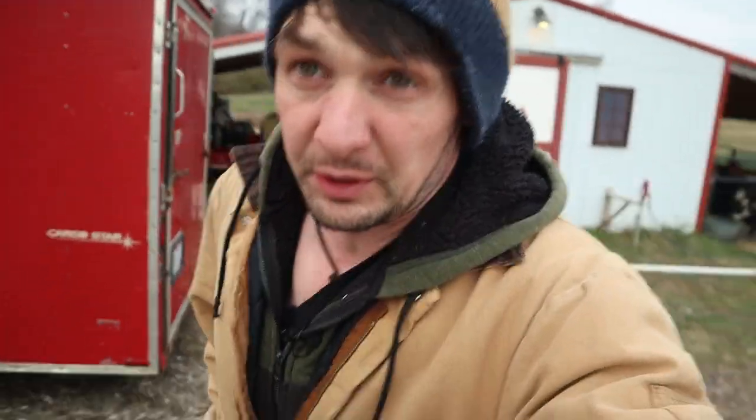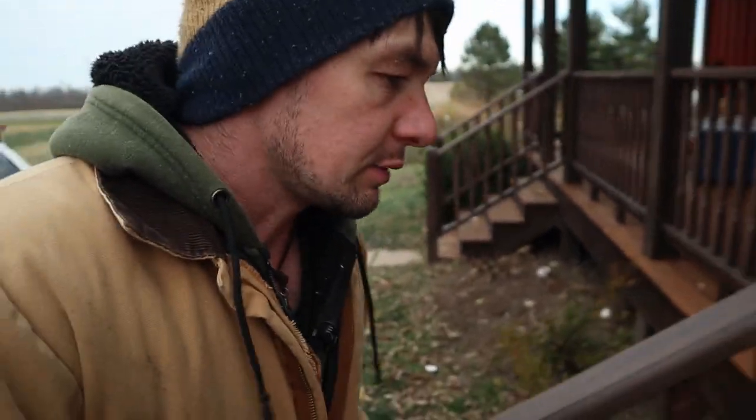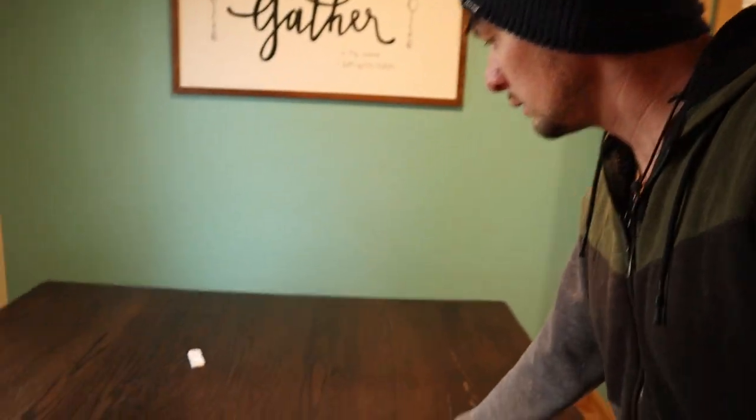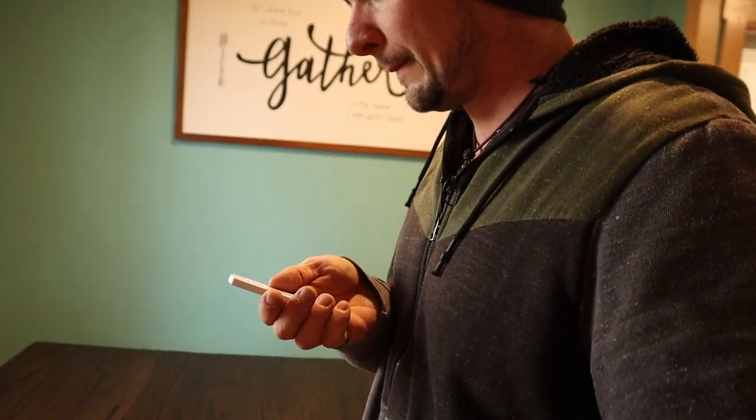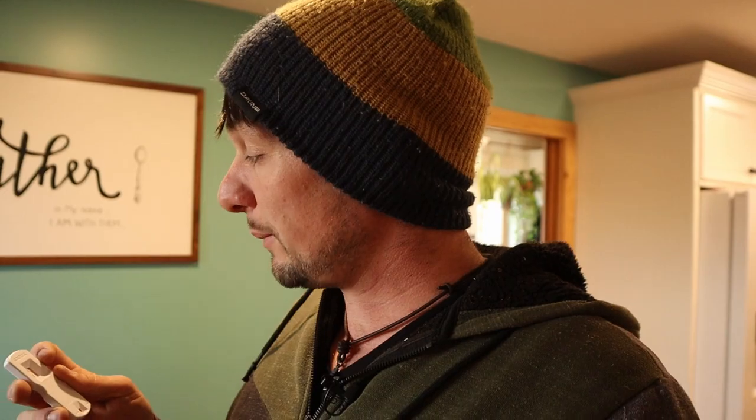The timer went off — let's go check the test. Super excited, a little scared. I was really afraid she's not pregnant because it sure did look like she was in heat. But since it was a little like that last year, I thought maybe she was actually pregnant. Let's see what it says. That doesn't look good — only one line at the top, which means she's not pregnant.